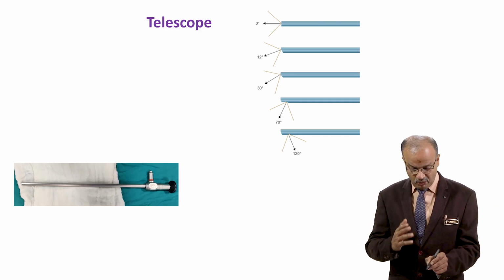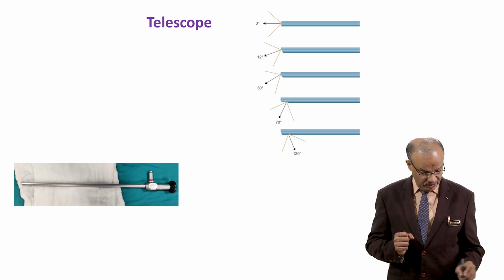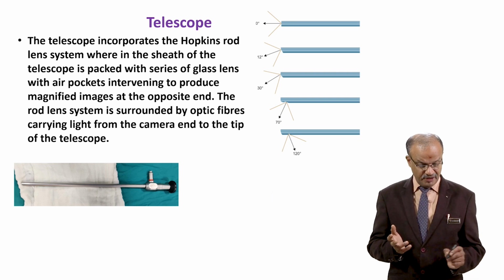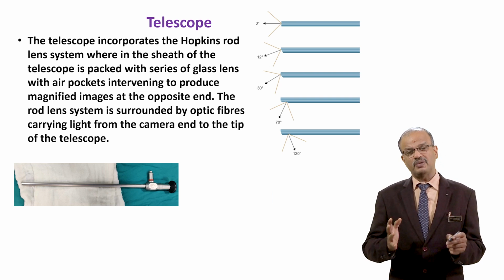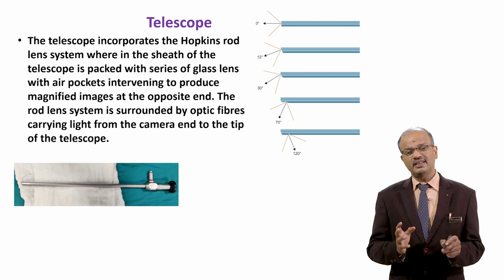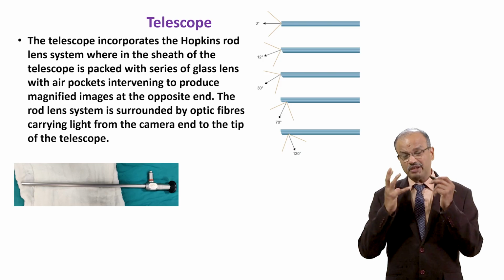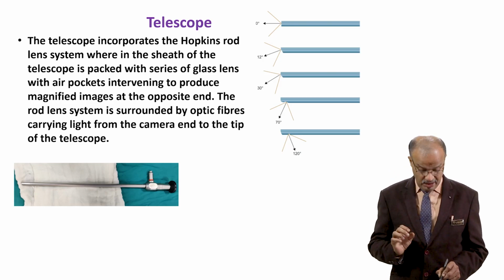That's an important thing. You can see how exactly there is a slice here, how exactly 30 degree telescopes are seen. See that? The image is very clear. So it's an optical lens system; the sheath is there, optical fibers, lenses, light source, the light cable connected there, and so the image is identified and transferred to the monitor.